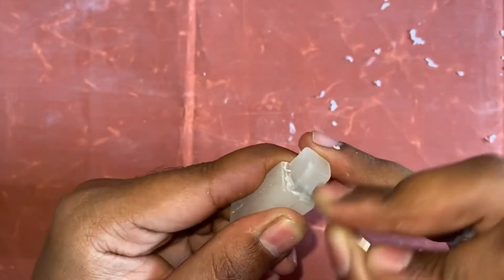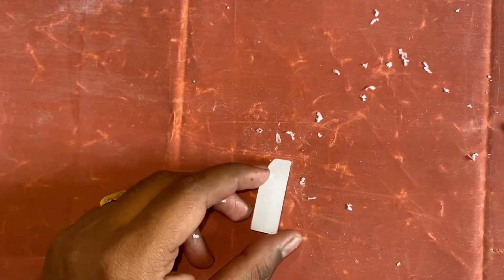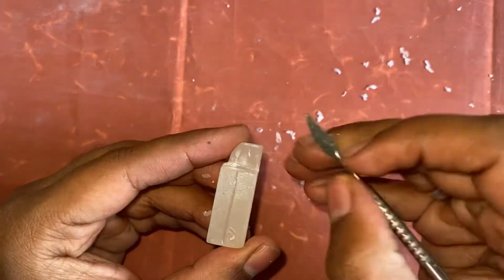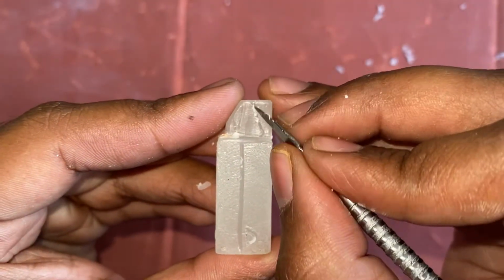Scrape the wax from the labial side or the buccal side, and then you have measured here the buccolingual dimension, that is 6 mm. Now you are going to remove the wax from the lingual side. You are already given the outline. Now just along the outline you have to remove the excess wax.